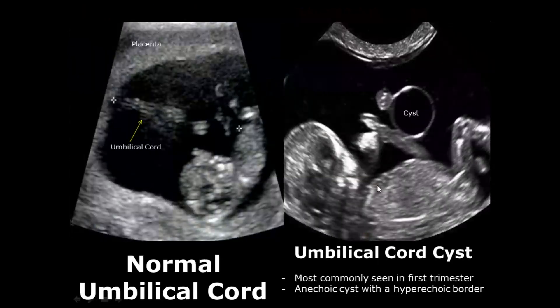Umbilical cord cysts can also occur. Most commonly they occur in the first trimester. Here in the normal image you can see a normal umbilical cord, and over here you can see an anechoic cyst with a hyperechoic border — this is an umbilical cord cyst.